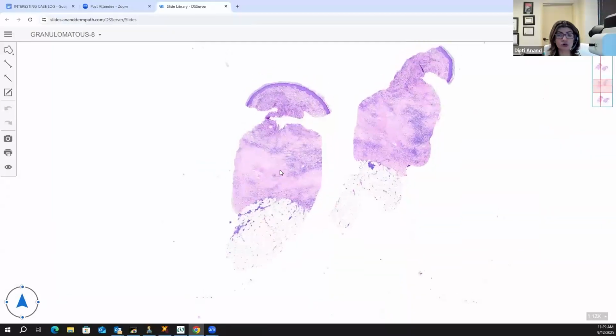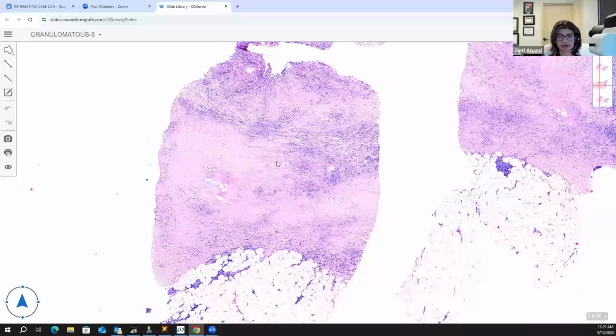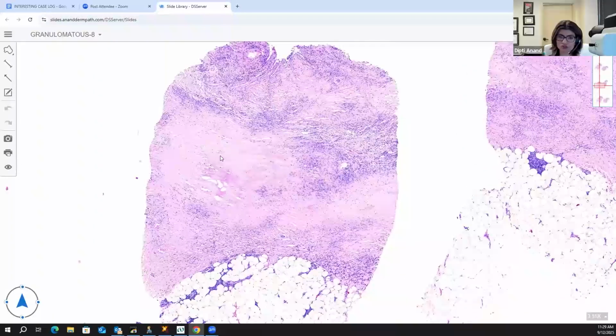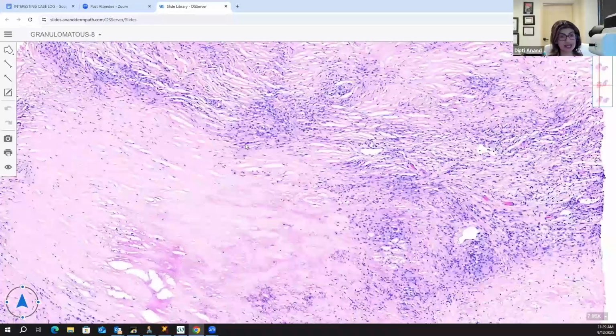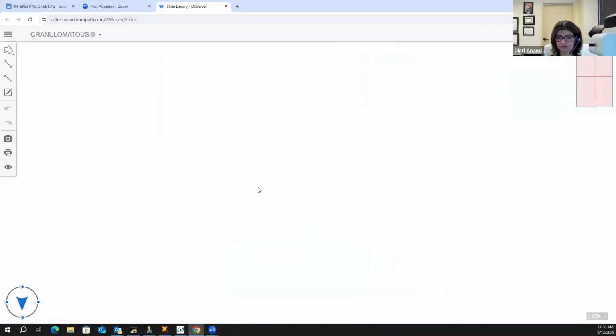Okay. And remember that the later the lesion gets, what will it mimic? The older the NLD gets, what will it mimic? Morphea. Because the inflammation will subside, but the sclerotic collagen will remain. And you can see how it will give you the nice squared-off effect. But then if you see any remnant of a granulomatous infiltrate, it's NLD, it's not morphea. Okay. The next one is slide number 9.